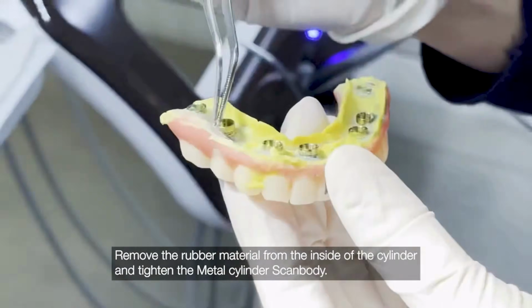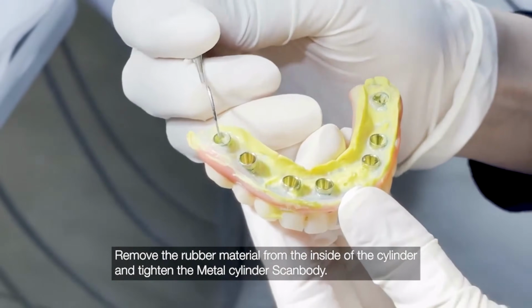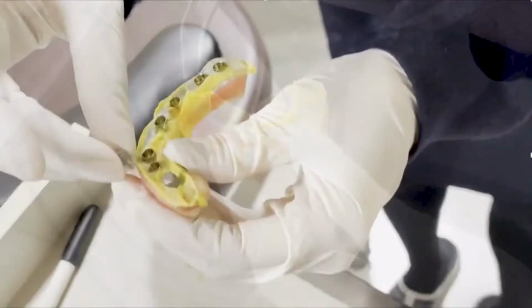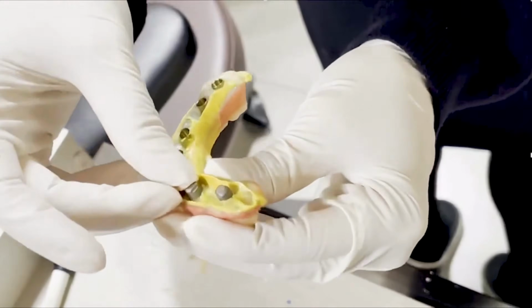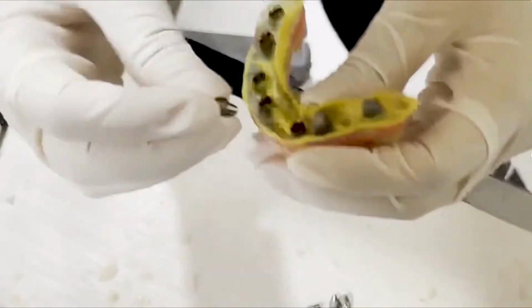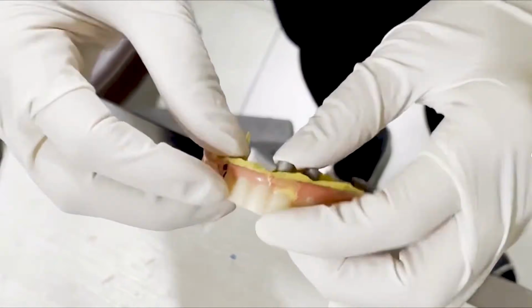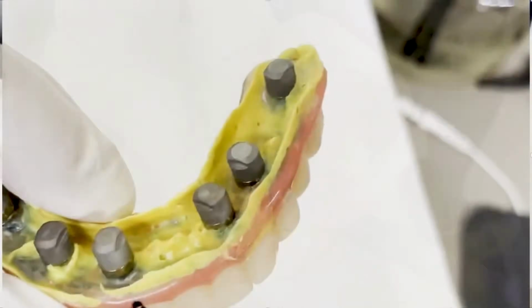Explaining the video. Now let's understand the steps in this video. First, the denture is placed in the mouth. The light body material is applied inside the denture. The light body records the soft tissue and denture adaptation before scanning. After that we begin the digital workflow.